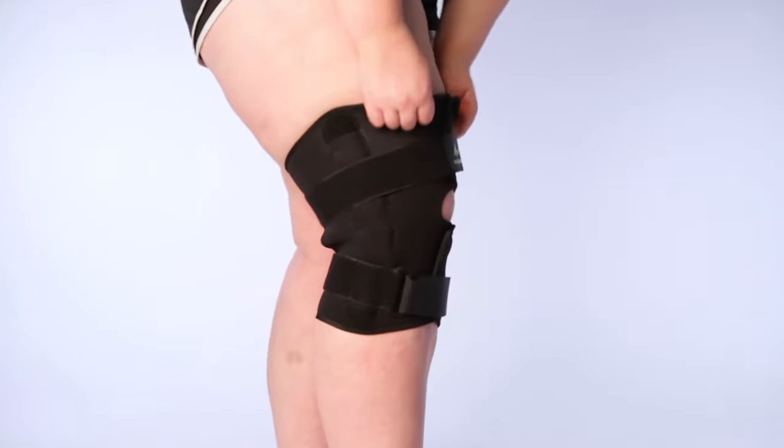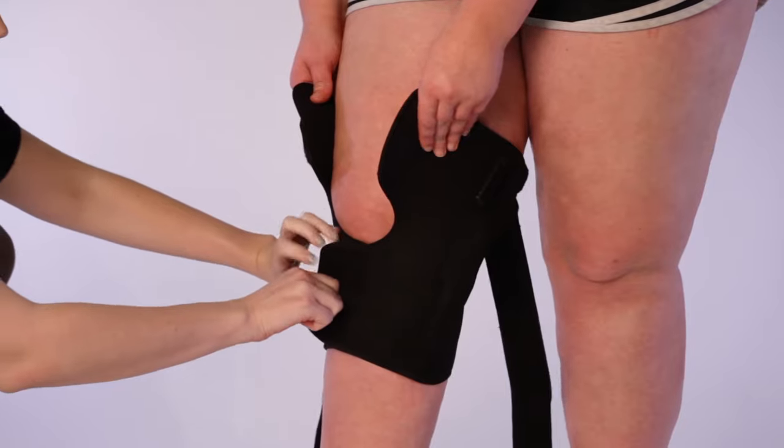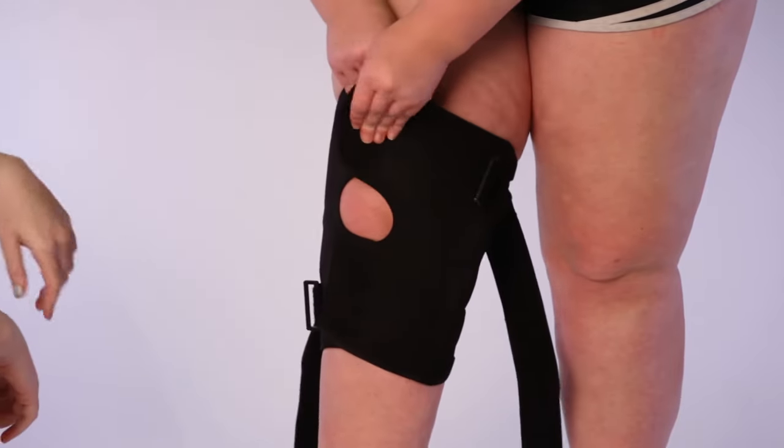Even when wearing the brace correctly it's going to slide down your leg and that's due to gravity, so if that happens no worries — just pull it back up and continue on with your day. Some people might need assistance putting this brace on and off, so don't be afraid to ask for help.